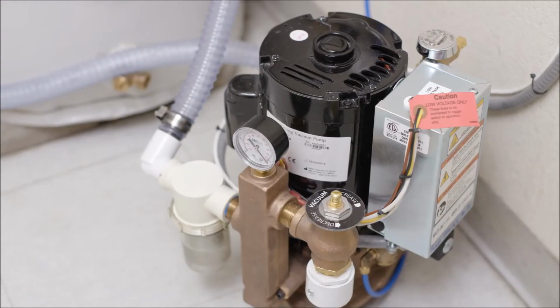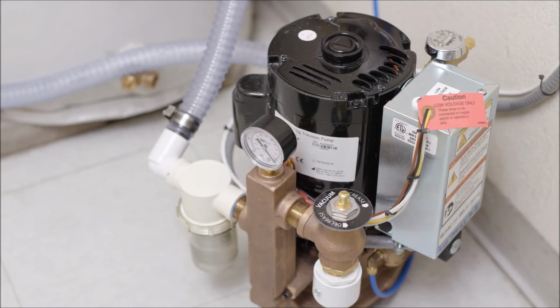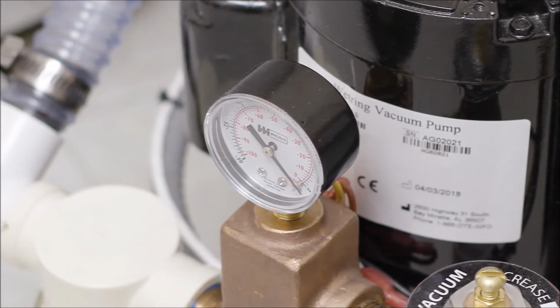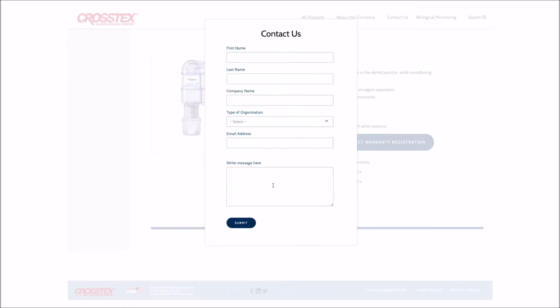Note the vacuum gauge reading again. The reading should be the same as before the canister change. If there is a major change in the reading, troubleshooting of the system may be required. Please contact your preferred service technician or Crosstex customer support.